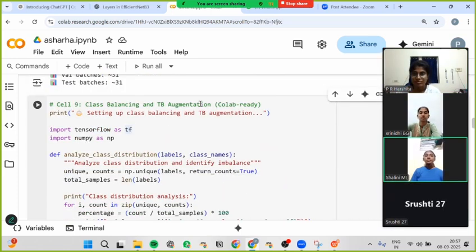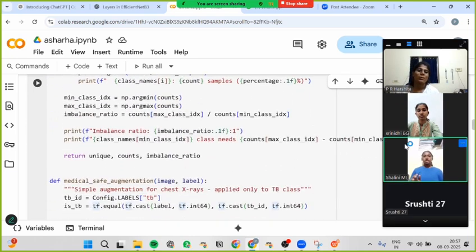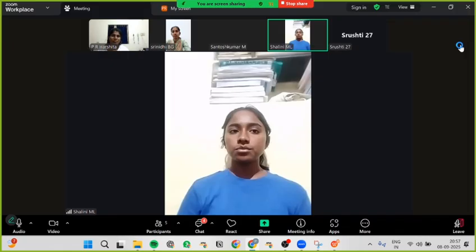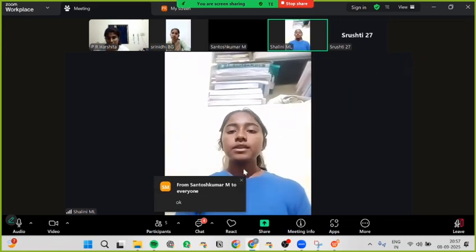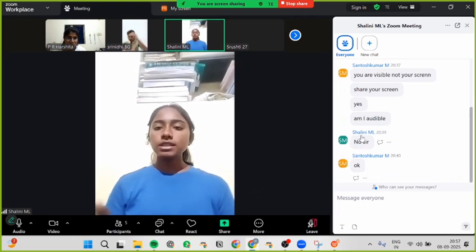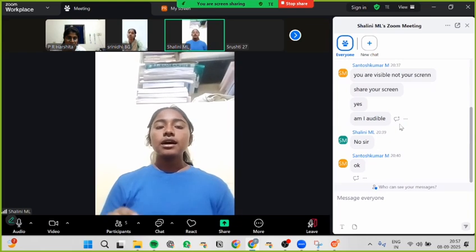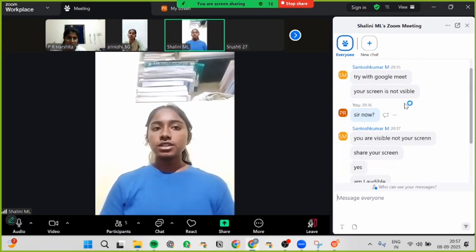So we will be discussing requirements and edge cases. First, our model isn't just a simple yes or no classifier. It's a multi-class classification problem. Like if we had used only normal or only pneumonia detection, then it would be a binary two-class classification problem.